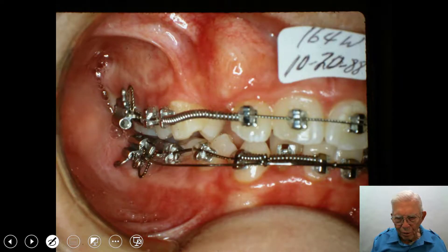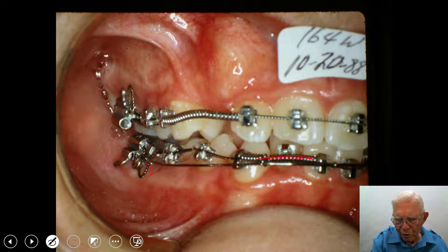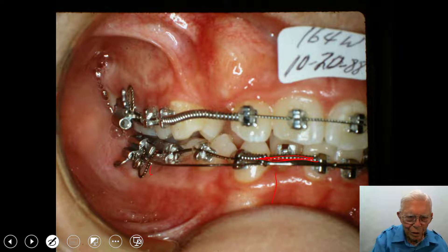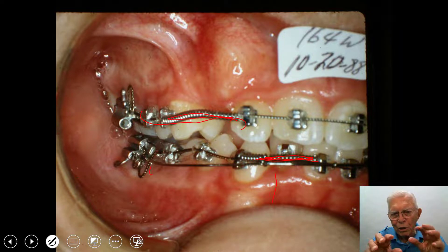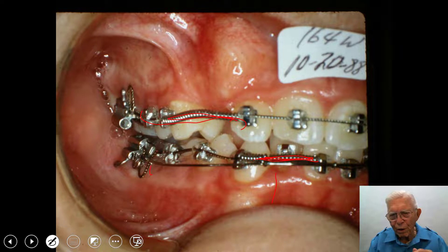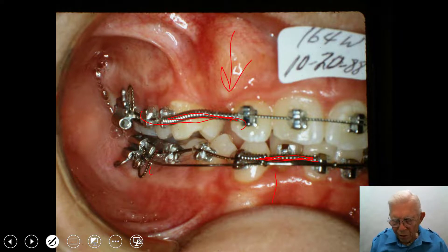Let's take a look at it from this side. He's got a flexible expanding arch in here, and we're opening up this gap. You see this spring here for this cuspid to come through. We're opening this up — he's got a spring in that area too. So we're enlarging both the upper and lower arches for the teeth. His facial structure can stand that, and we feel like it can. And the cuspid is coming in right there.